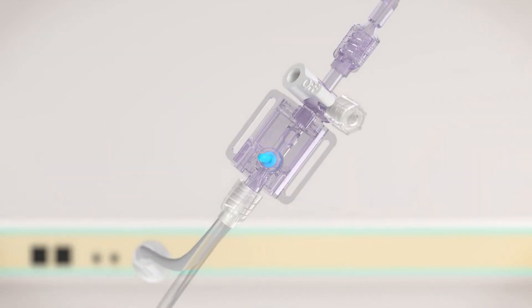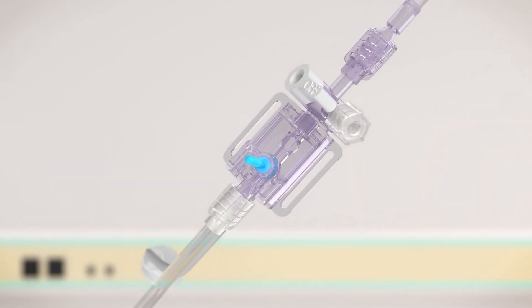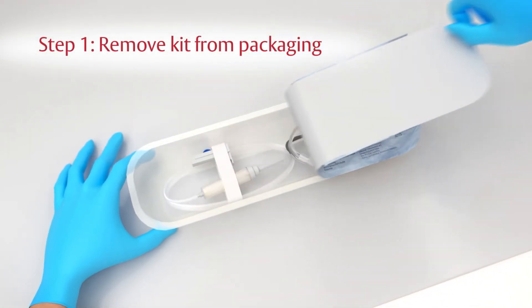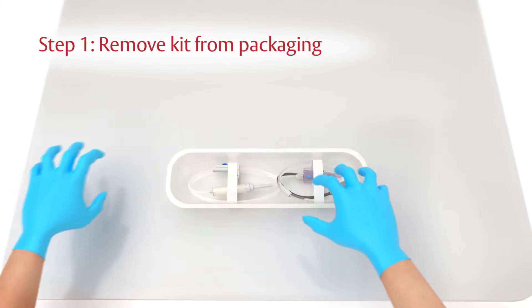Prepare the TruWave transducer using the following five steps. Step one: using aseptic technique, remove the transducer kit from the sterile packaging and ensure all connections are secure.